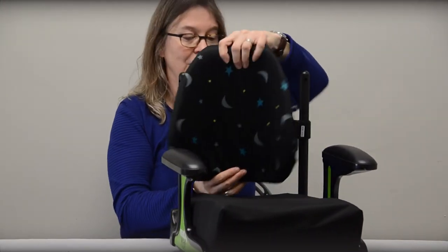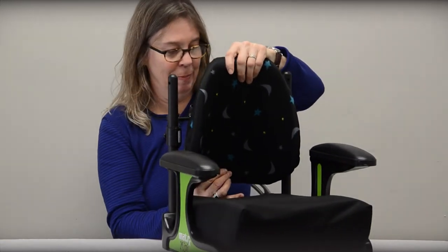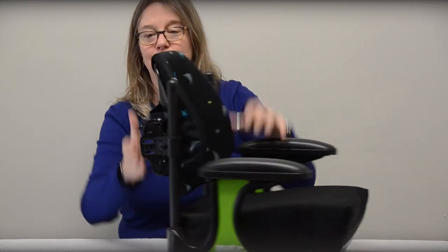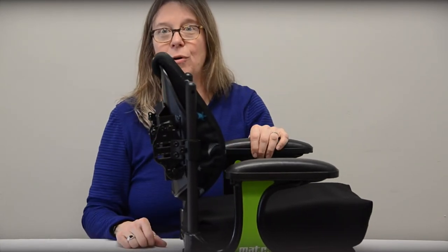I can set the angle, and if this were on a folding frame chair, I can still collapse and fold the chair or stroller. When I put the back in again, it locks back into place at the same angle that we preset optimally for our consumer.